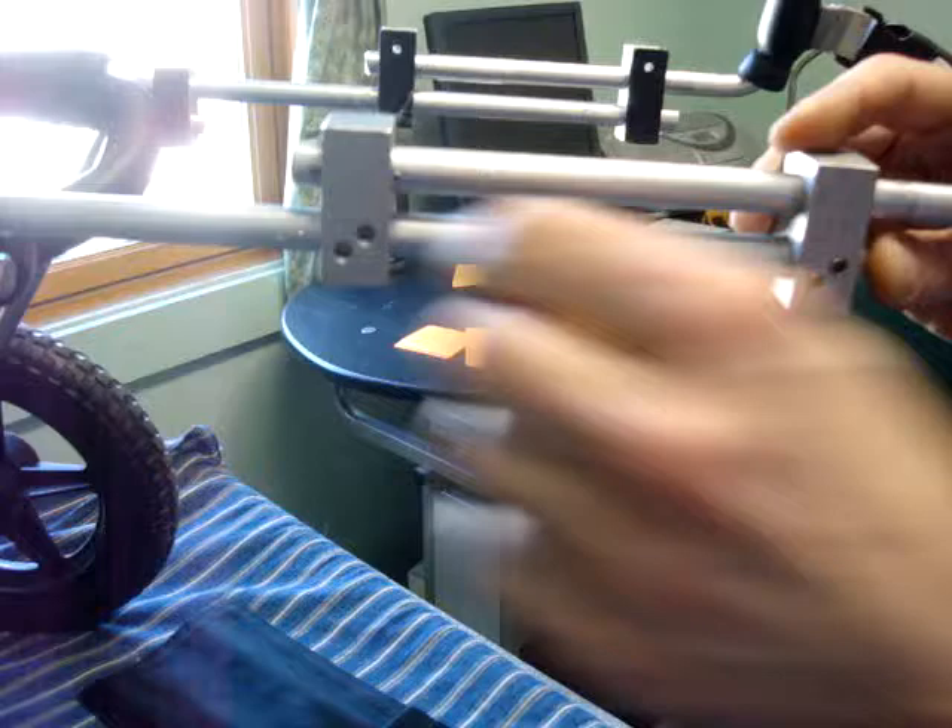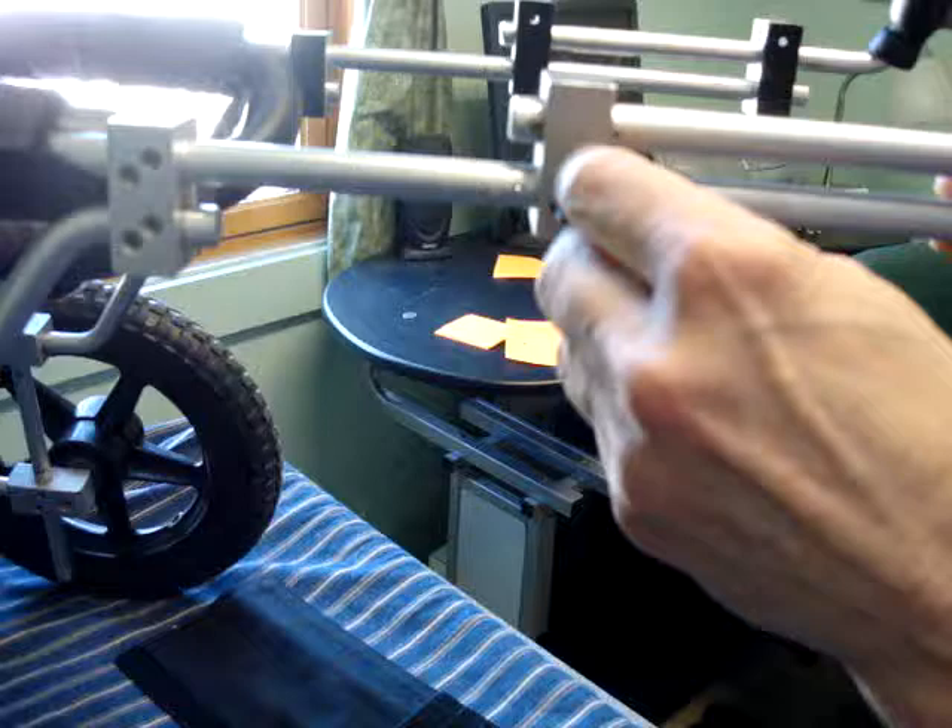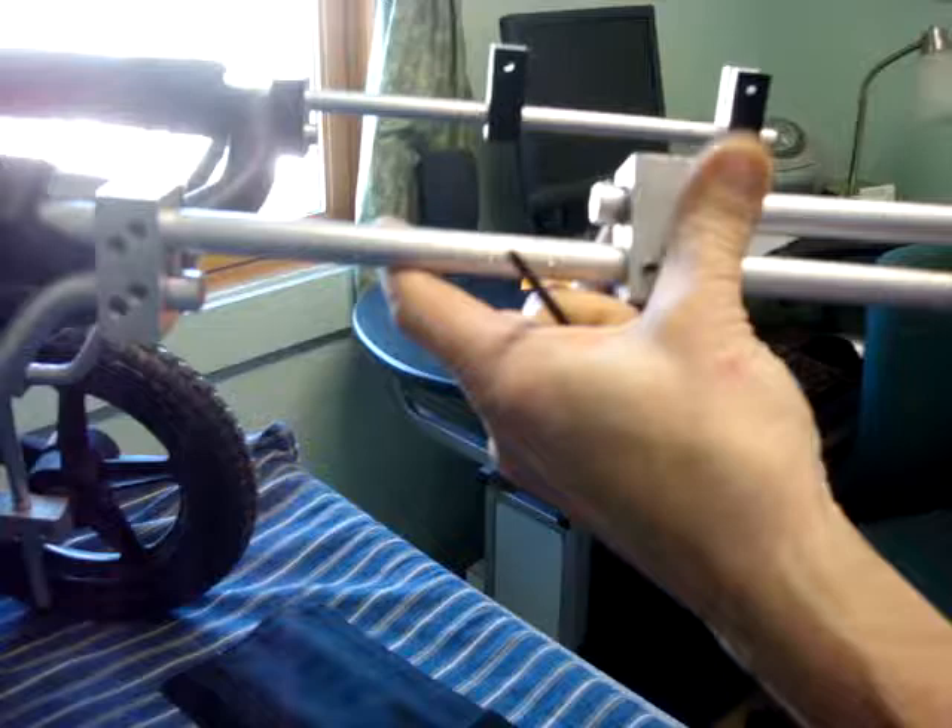We're going to have to slide the whole yoke off, or at least up, so that we can get to the collets, which are these metal circles behind.